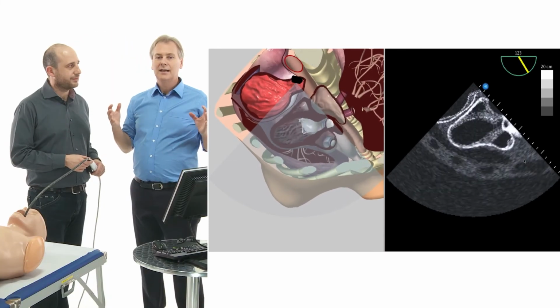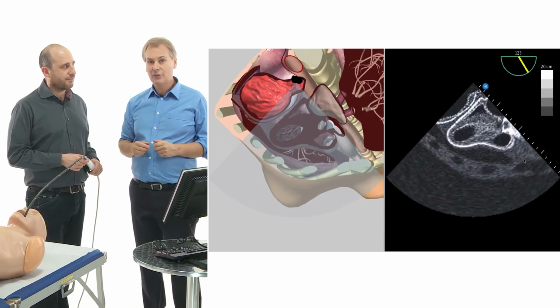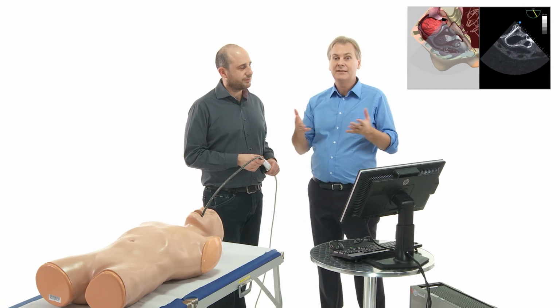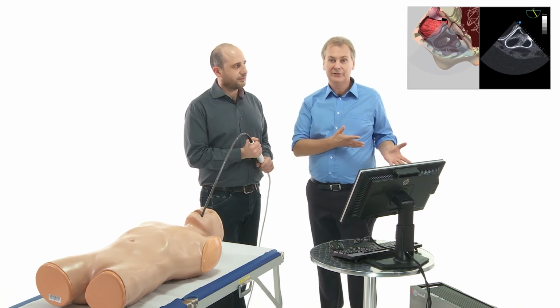Right, so as a take-home message, yes, we can quantify aortic stenosis with TEE. We can even use it to assess prosthetic valve function. If we want to look at the gradients of an aortic valve prosthesis, it can be done. Of course, you will need a lot of practice, but I can guarantee you, if you practice it often enough, you will know how to do it if a patient comes along where you have to do it.